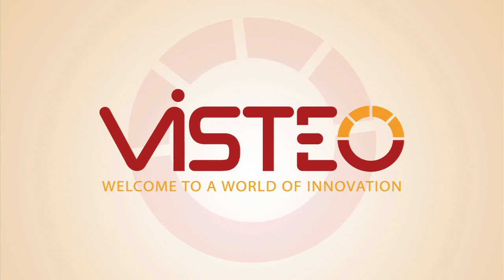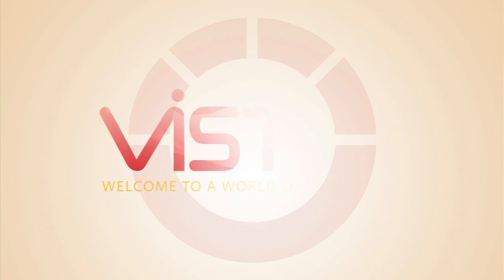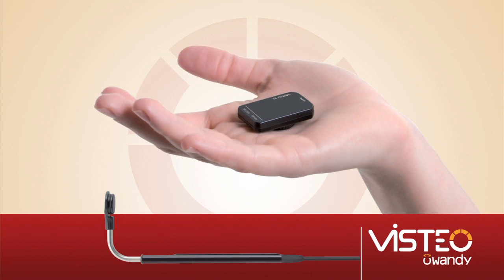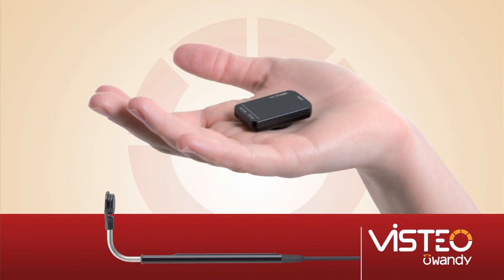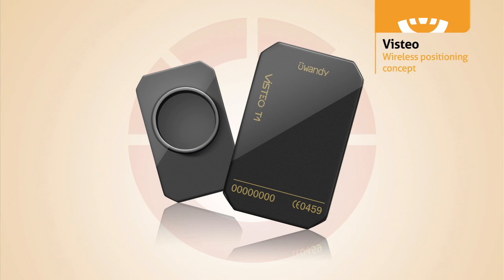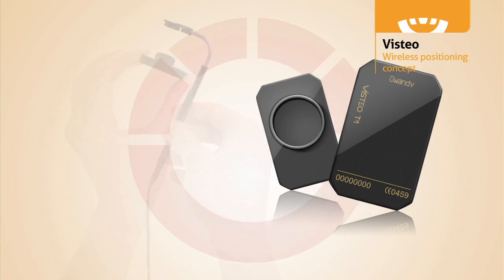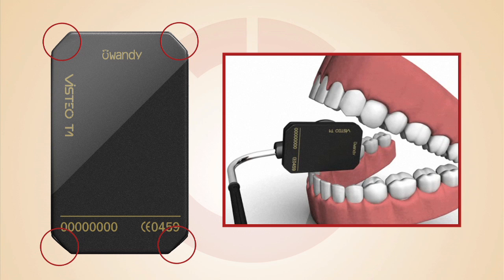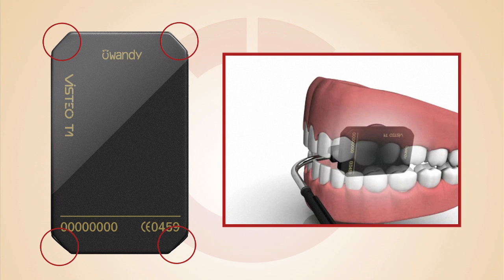Vistio uses a new, innovative technology called induction, which allows us to combine all of the benefits of all other sensors on the market into one single product. The sensors, size 1 or size 2, snap onto the stainless steel cable protector, becoming instantaneously operational. The sensors' corners are rounded for comfortable placement in the patient's mouth.